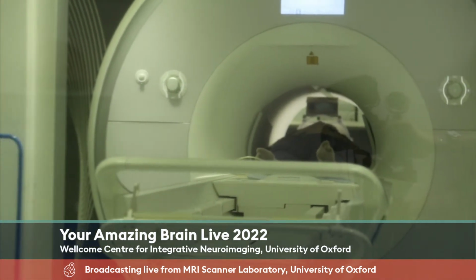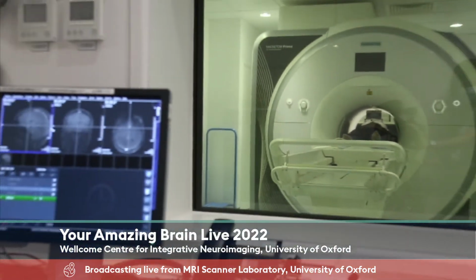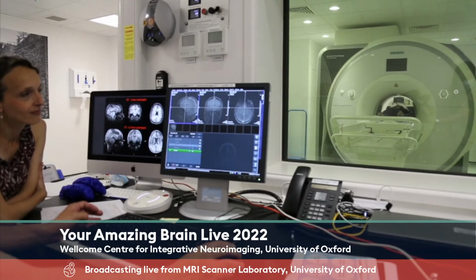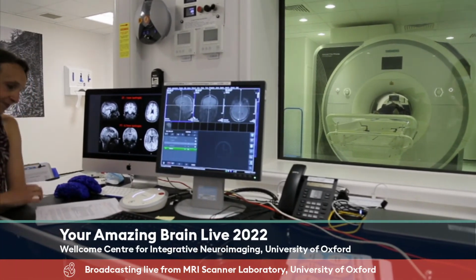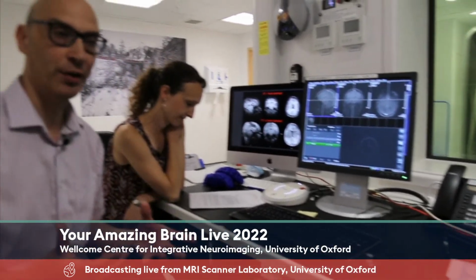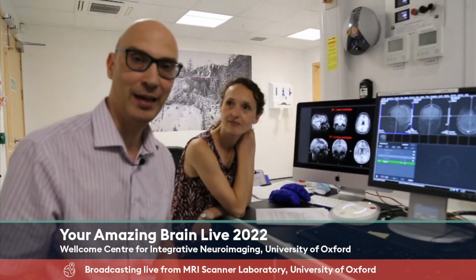Okay, so we'll start the scanner off again. So maybe you can hear a few noises while the scanner is going. I don't know if you can pick it up on the microphones, but the scanner is quite noisy, and that's something that we just can't avoid. It's part of taking the pictures.